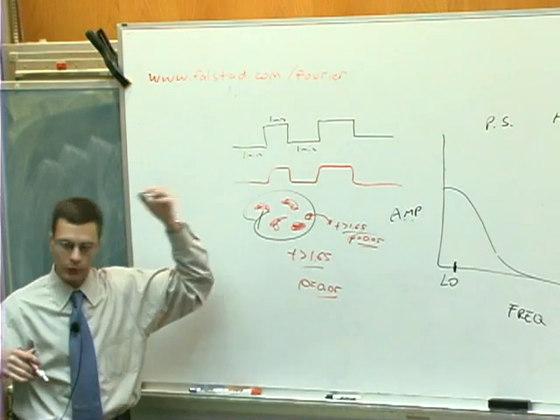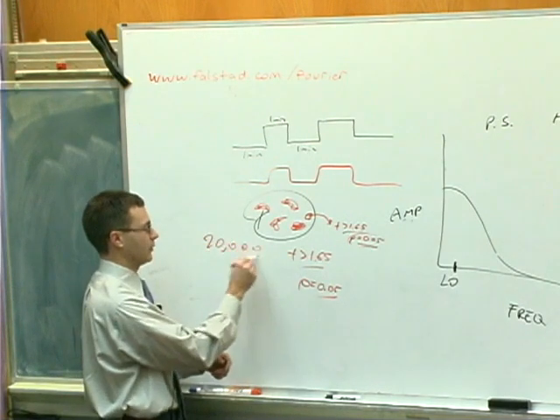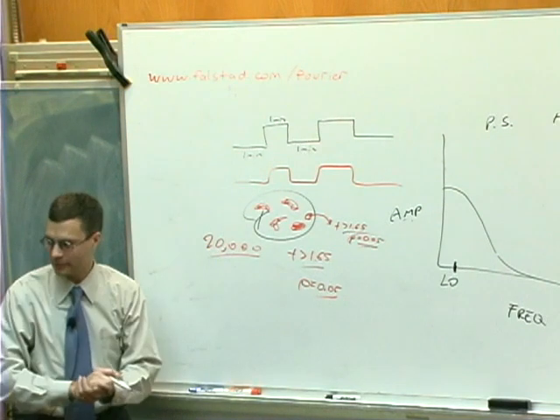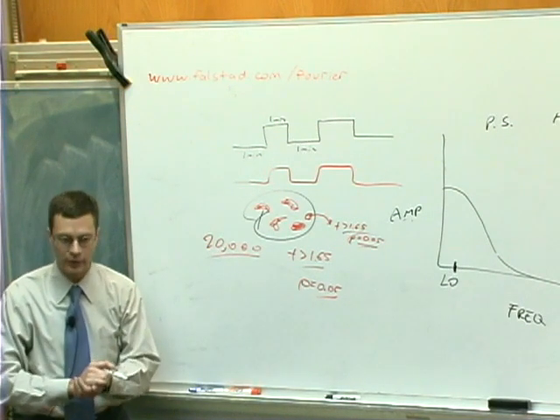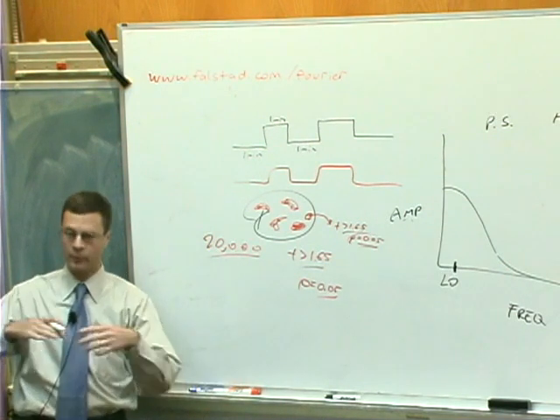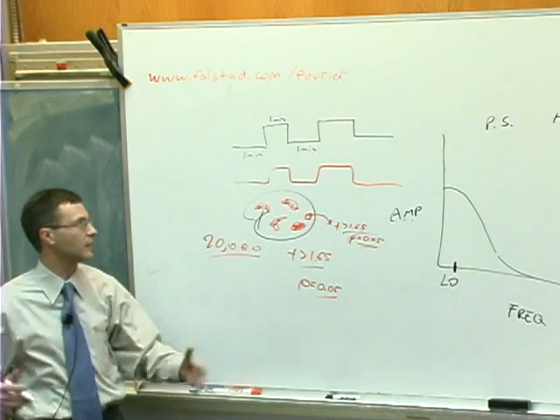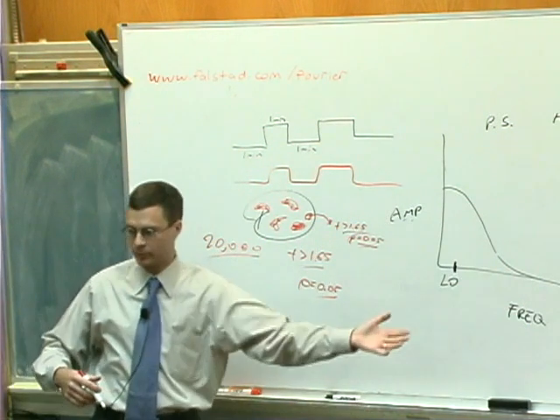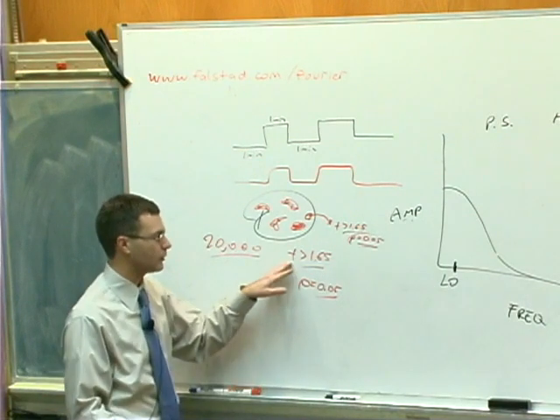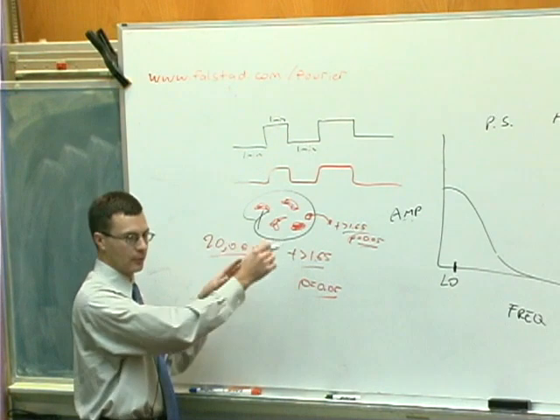Okay? So, all right, well, I'm not dealing with 20 voxels. I'm dealing with 20,000 voxels. So if I have a threshold of 1.65 for each of my 20,000 voxels, then there's going to be an enormous number of voxels which have a significant effect just by random chance. Just the random fluctuation of the noise is going to happen to look a little bit bigger during semantic judgments about Braille reading than during the other sorts of things. So this is wrong. Obviously I need a higher threshold to correct for the fact that there are 20,000 little voxels that I'm comparing.